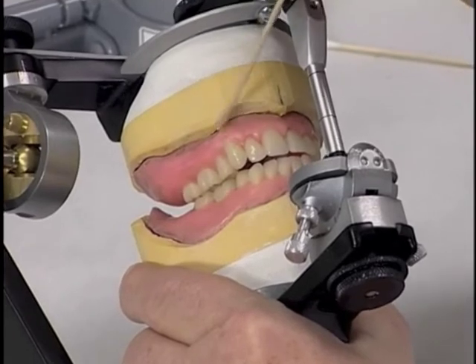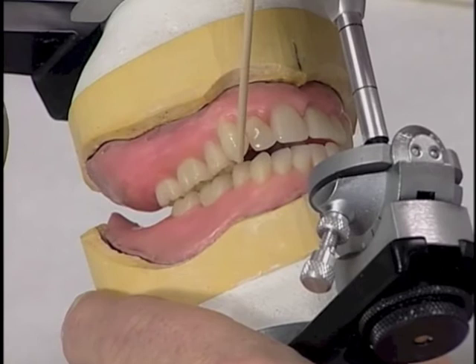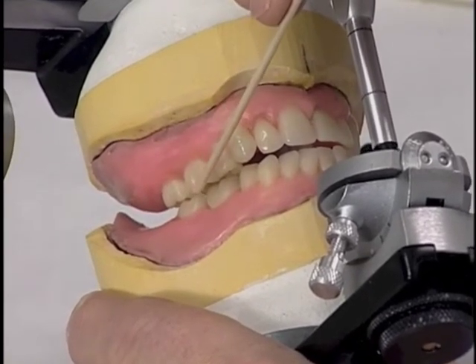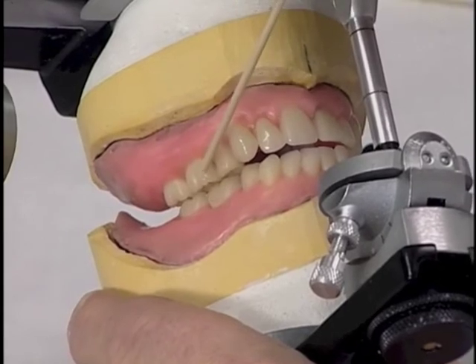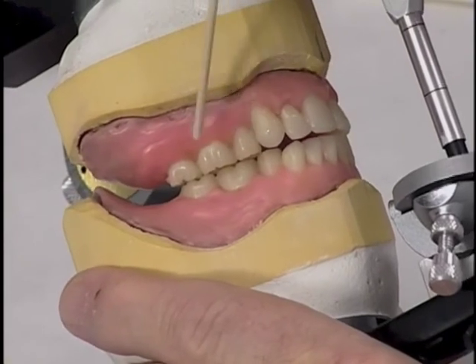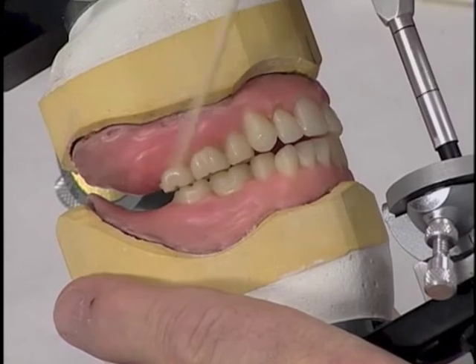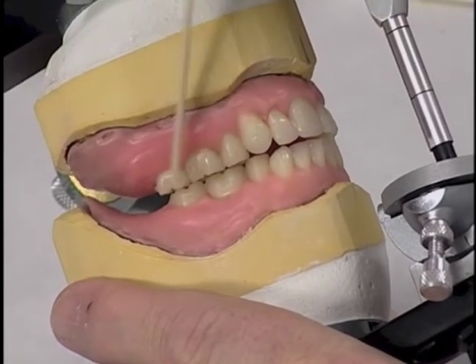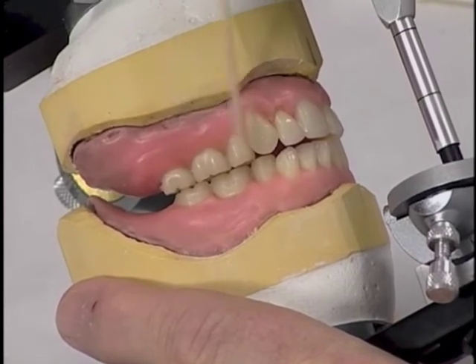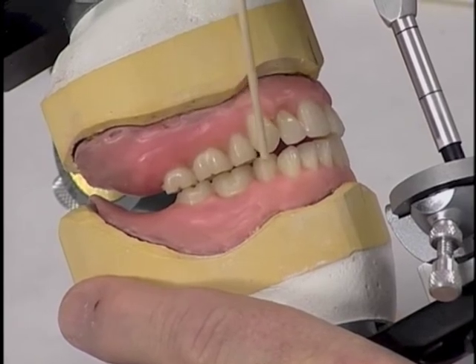And in this particular arrangement of teeth for this particular patient, this turned out to be a normal arrangement of the posteriors in that the maxillary teeth overlap the mandibular teeth by 2 to 3 millimeters. Also, notice that simply because of the size of the arches and where this posterior part of the ridge started its ascent, since we didn't want posterior teeth on this vertical ascent of the ridge, we limited the arrangement of posterior teeth to 3 teeth in each quadrant.